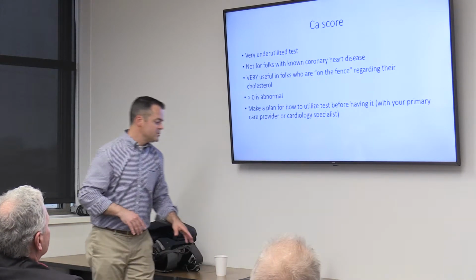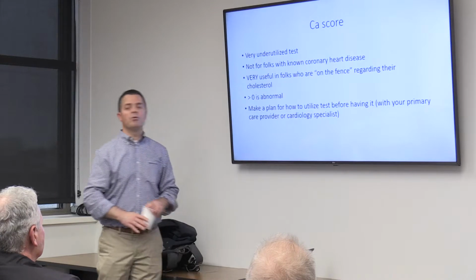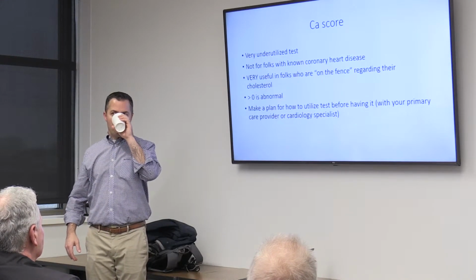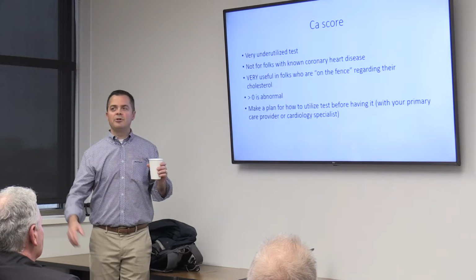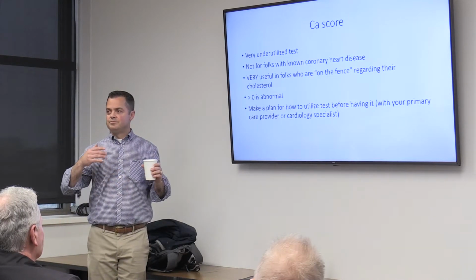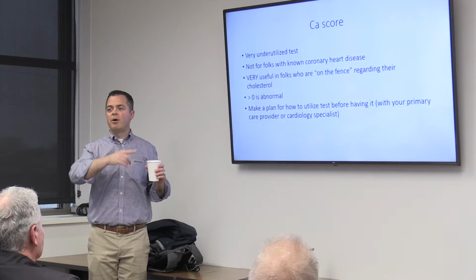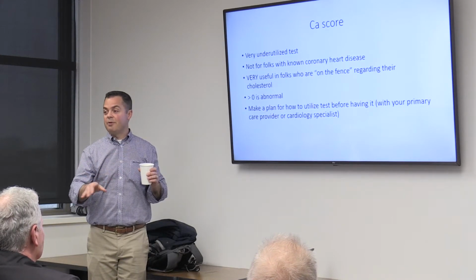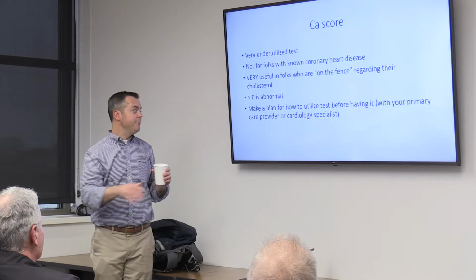Okay, so calcium score. This is another big ticket item. I talked about the CT scanner before. This doesn't require a fancy CT scanner. Let me say that again. This does not require a fancy CT scan.